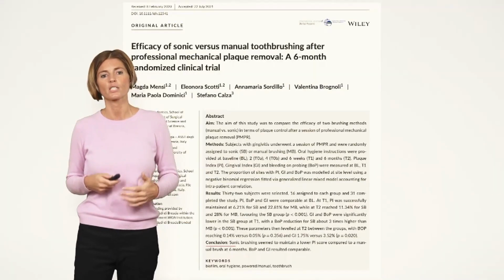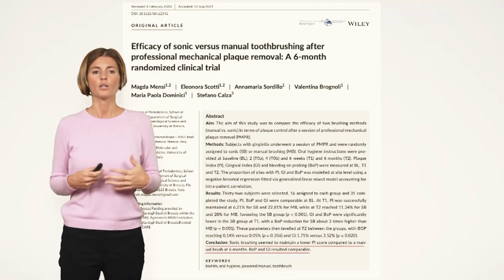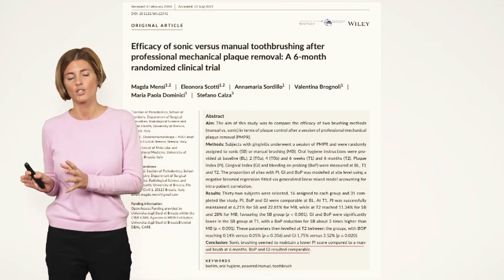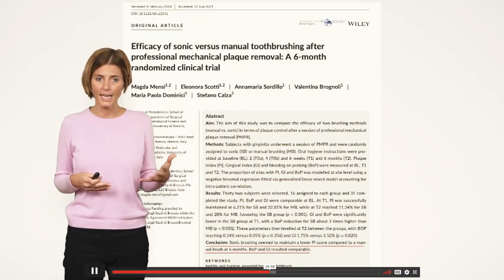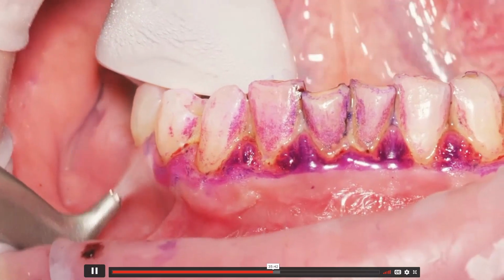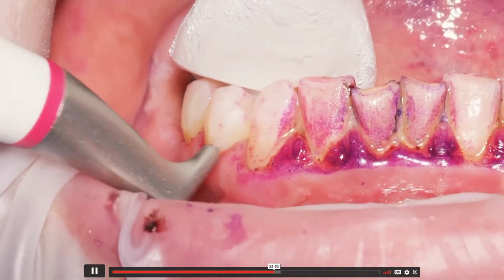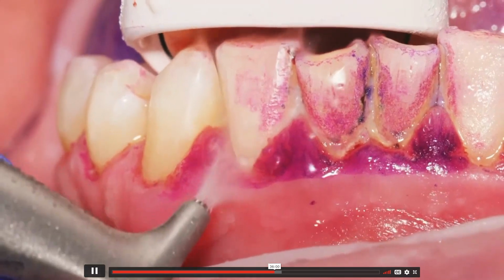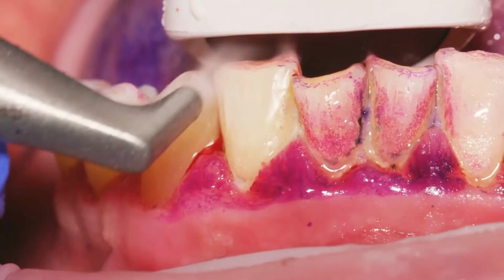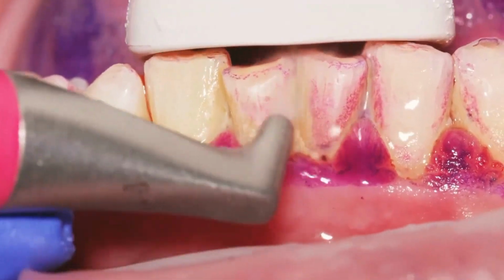So it's very important to explain the two things. And here again, the literature. We also published a paper where we demonstrate that the sonic toothbrush combined with the GBT sessions is superior. So we started with the powder, moving at a millimeters distance from the teeth and the implants in the same place. You need to move slowly to be effective and not to create any kind of damage on the soft tissues.